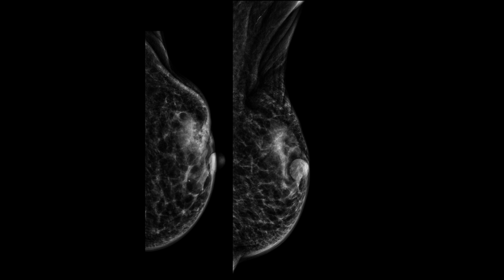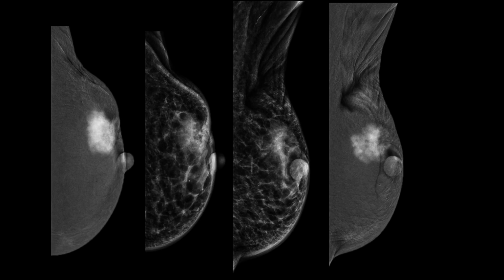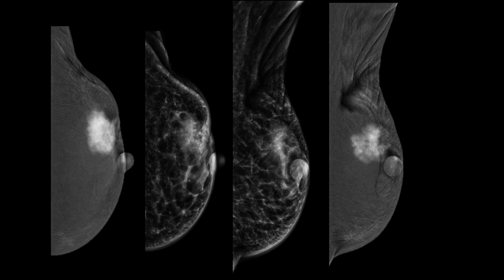This is probably, in my opinion, the most classic scenario when contrast mammography can be used and should be used, even for screening purposes. This is a patient with a history of previous lumpectomy. It is so difficult for us to say based on a standard mammogram whether there is just scarring or recurrent disease. These patients are usually being treated with tamoxifen, meaning that we don't expect background parenchymal enhancement, everything is going to be so quiet, and we discover that she has a recurrent disease. Even in ultrasound, this can be very difficult because there is scarring, and the scar tissue will cause shadowing, but with this, we know for certainty that there is something to biopsy and to look for.